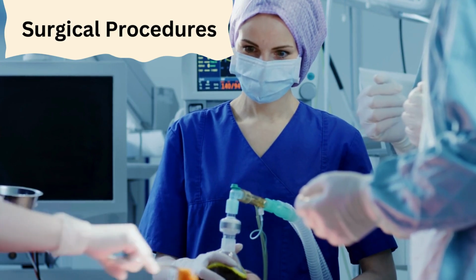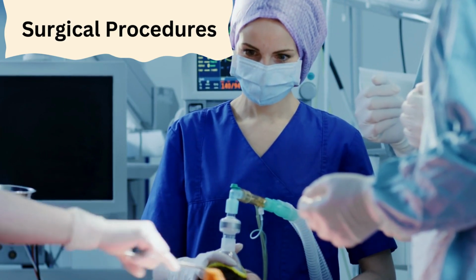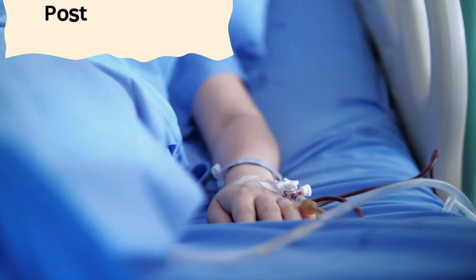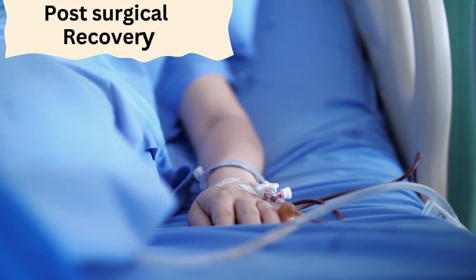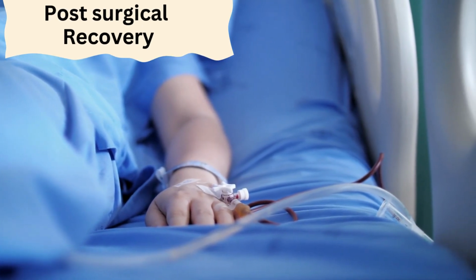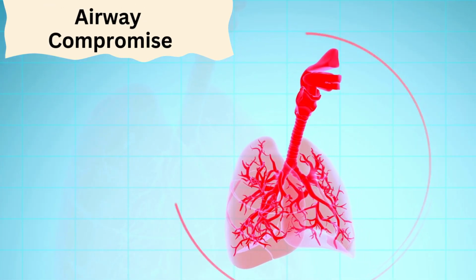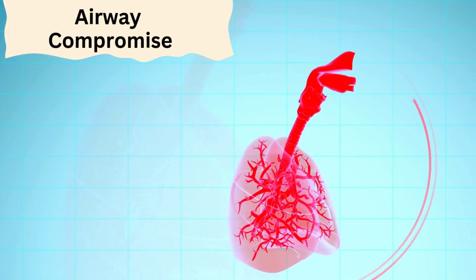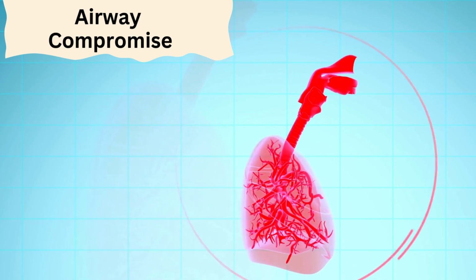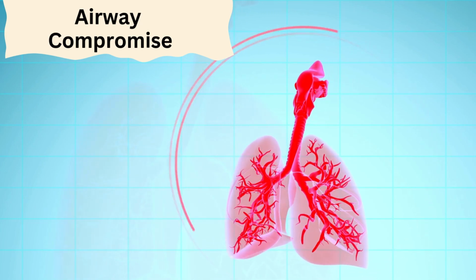During surgery, patients are often placed on a ventilator to ensure adequate breathing while under anesthesia. Post-surgical recovery: in some cases, patients may require ventilation for a period after surgery, especially for complex procedures. Airway compromise: any condition that obstructs or threatens the airway, such as airway burns or massive hemoptysis, may require ventilation.